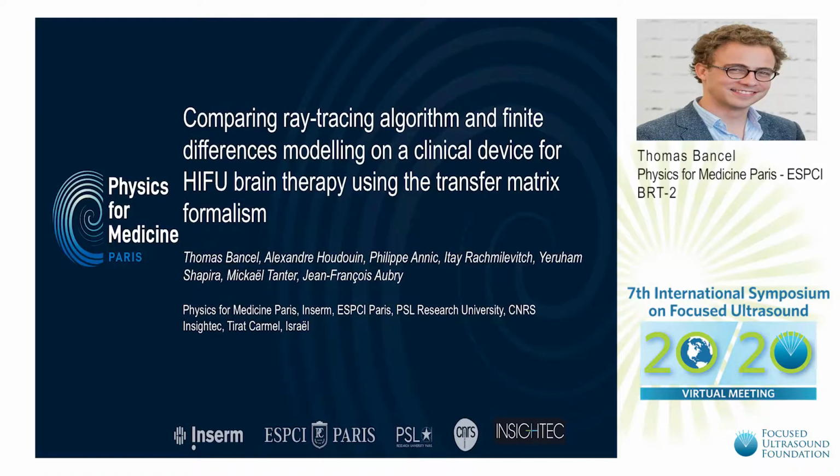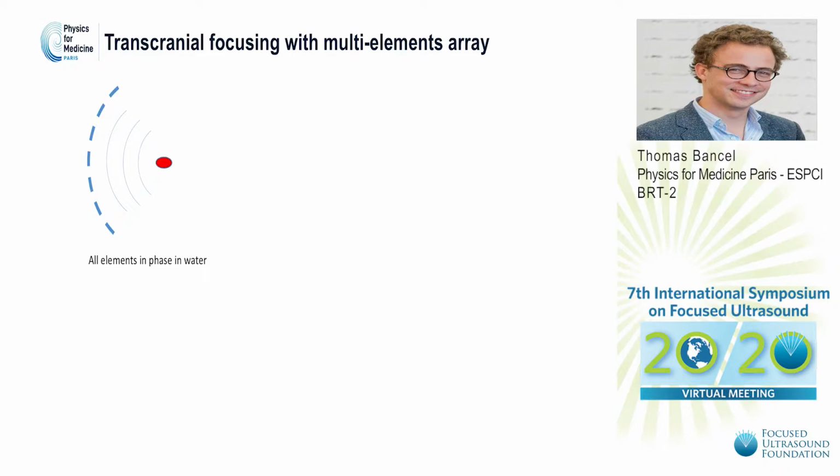Hello everyone, so today I'm going to show you the result of a study where we try to compare two approaches for transcranial simulation. The first approach is ray tracing, the one that Insightec developed in their device. Insightec is the manufacturer of the clinical device for transcranial therapy, and the other approach is the approach of our lab using K-wave.